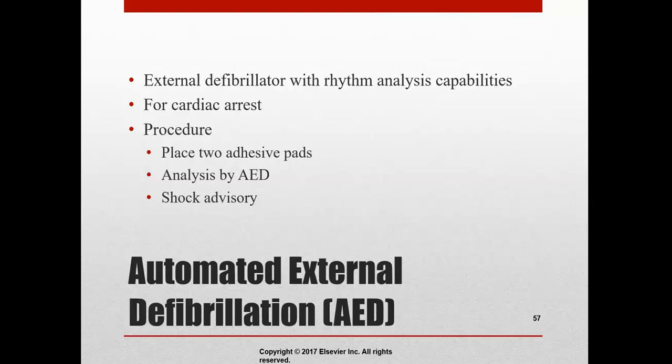Okay. So AEDs are automated external defibrillators, the ones that we're probably most familiar with in the hospital. AEDs are readily available in a lot of different places. If you've ever been in the nursing building, we have one on the second floor by the elevator. And I'm pretty sure that Reynolds has one over there somewhere as well, I just can't think off the top of my head where it's at.